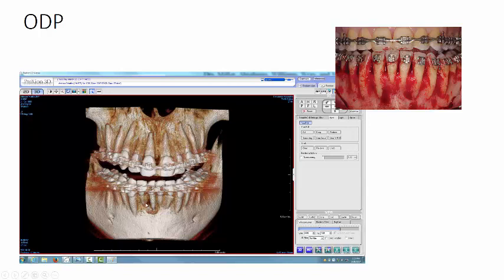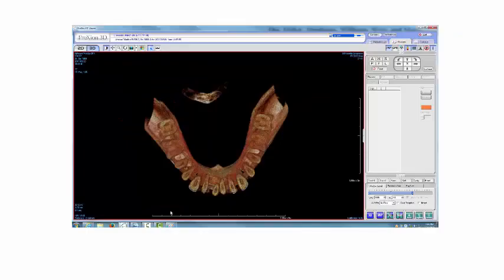This was an abscess associated with the lower right central incisor, which may or may not be coincidental. If you look at the axial view of the lower incisors, sliced through a little past the CEJ down the root, you can see it gives you a better idea of how much dehiscence has occurred. Now, 53% of all teeth will have some form of dehiscence or fenestration — that's fairly well documented — but it's the magnitude. When you see this generalized pattern of dehiscence, it's not what occurs naturally. This occurs as a result of orthodontic overexpansion or violation of the bony housing.